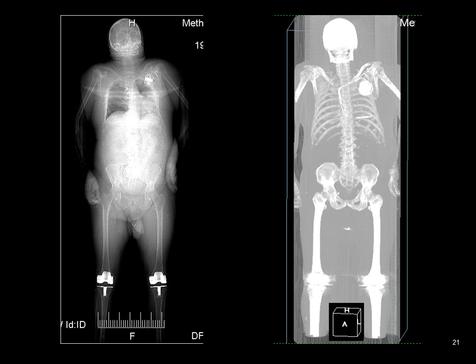The spine, dome of the diaphragm over the liver, dome of the diaphragm over stomach and spleen. We see some cardiac silhouette or shadow, and this is a pacemaker defibrillator. We can interpret that that's what it is because of the number of leads. There are 4. If we look at the bone window here, basically that's a filter that enhances the bone.